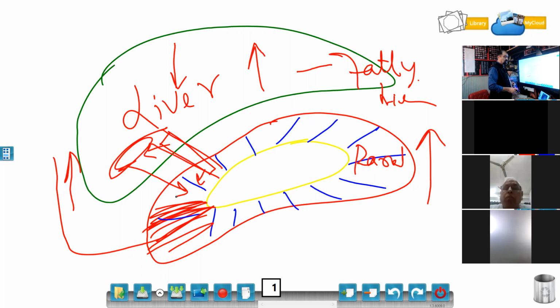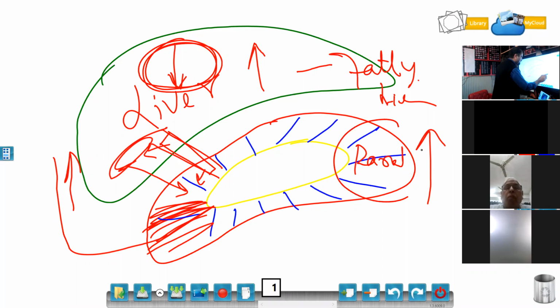But make a note over here. Maybe the liver has decreased in echogenicity. Maybe there is inflammation in the liver. Why not hepatitis? So take the history, look for signs of hepatitis, and if there is hepatitis, then it will look like the parenchyma is increased.